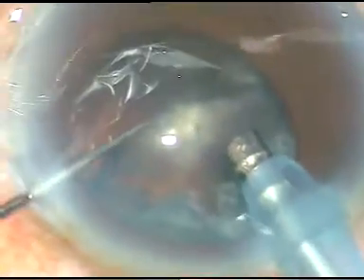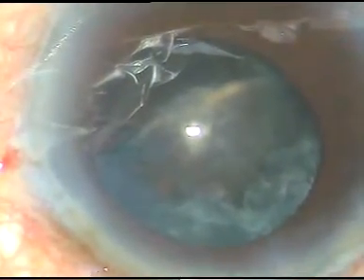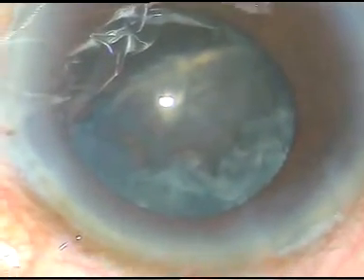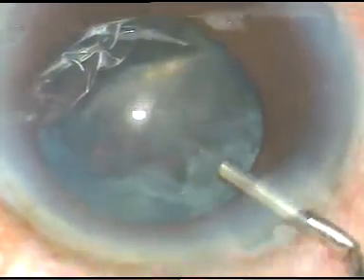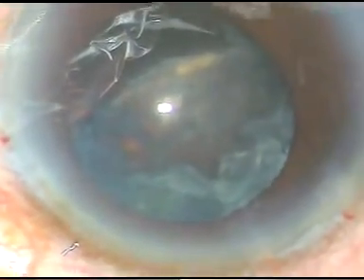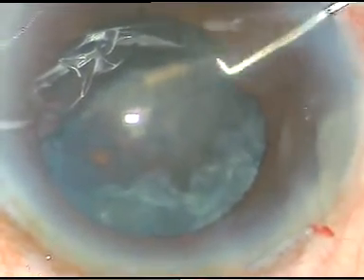Dear colleagues, in this case posterior capsular rent occurred. Let us see how it happened and how I managed the case. The last piece of epinucleus has been emulsified and taken out, and now we can see that there is a thick sheet of epinucleus remaining there. And now it is more than half of the epinucleus.